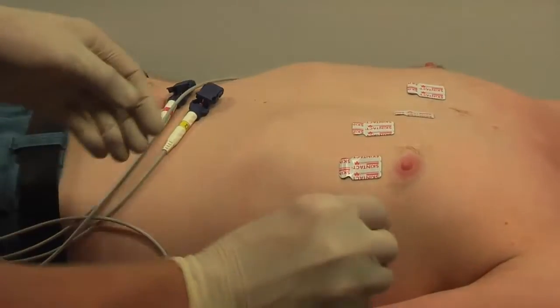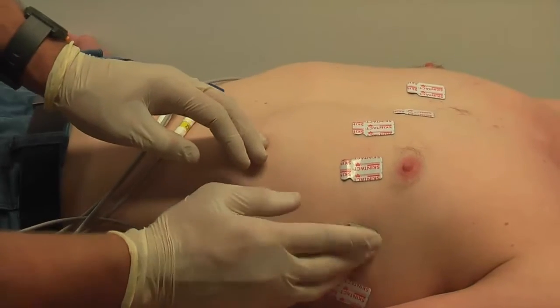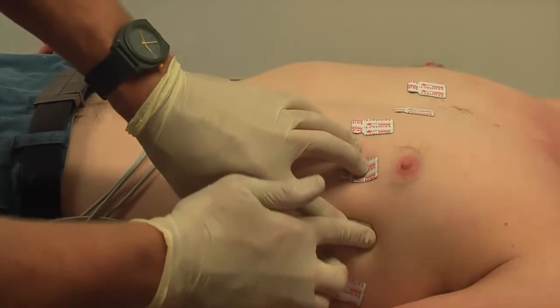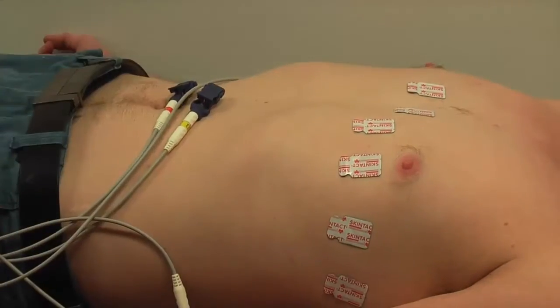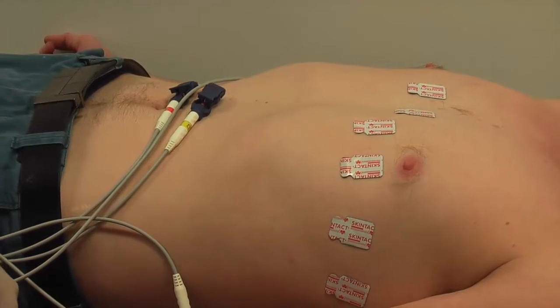It will take a little bit longer to put the electrodes on, but the resulting time that you save trying to correct bad lead artifact or baseline wander means you're saving time at the other end.